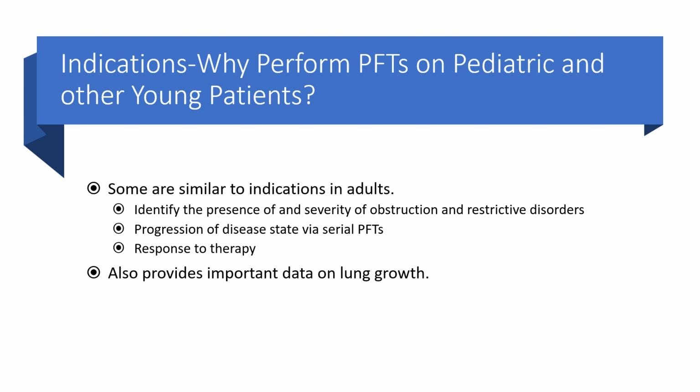Or if an asthmatic patient is adhering to the treatment plan, they and of course their parents if they're a pediatric patient, can see that they're maintaining their flows adequately and perhaps their response to bronchodilator therapy, the pre and the post. So it'd be very, very useful in looking at those particular areas. In addition, for this patient population, PFTs can also provide some useful data on lung growth. Okay, lung growth.